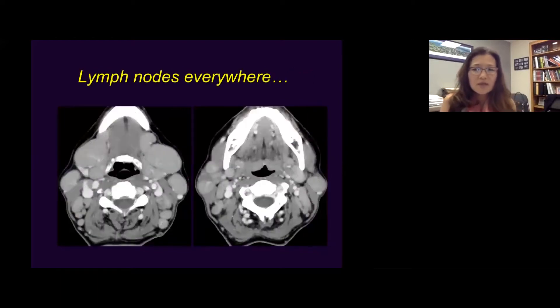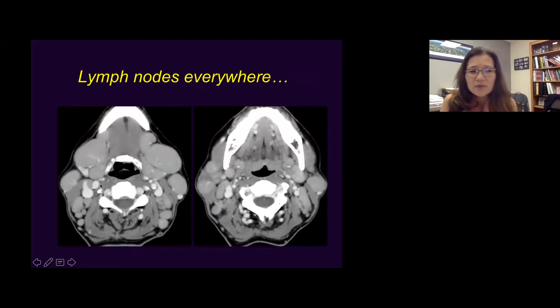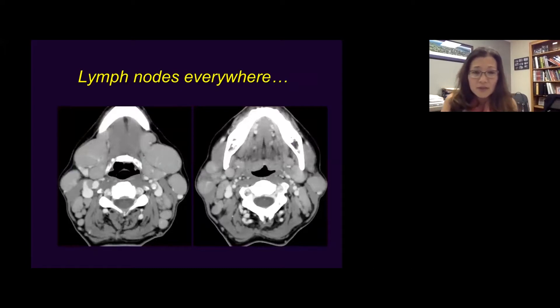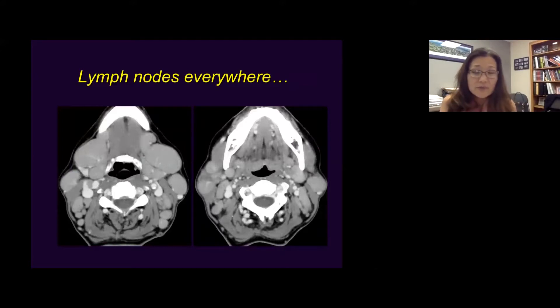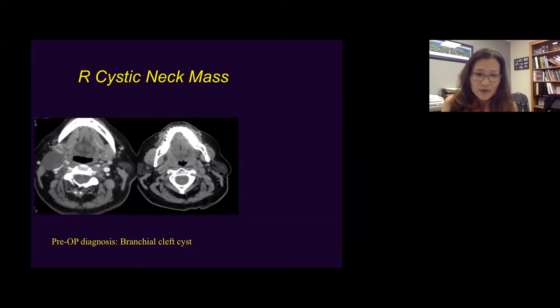Another patient had bulky lymph nodes everywhere. This particular level 1B node was so large it was compressing the submandibular gland. There were superficial nodes, and multiple levels two and three lymph nodes — bilateral, essentially everywhere. The differential diagnosis for those patients includes lymphoma, leukemia, and sarcoidosis as the top three diagnoses. That patient had sarcoidosis.